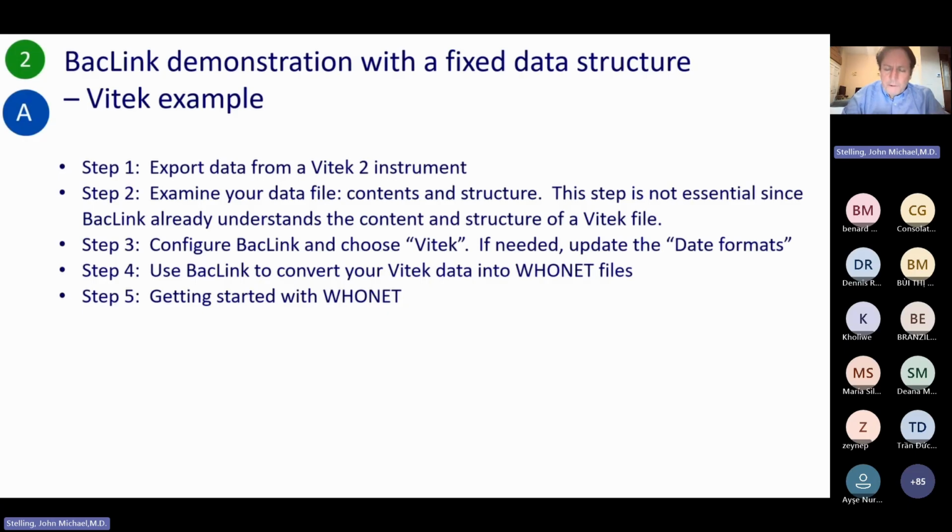As I mentioned, what are the contents? Is everything there? Are the positives there? Are the negatives there? DISC, MIC test. If you're working with Vitek, it's valuable for you to do that, but it's not essential because BacLink already knows the answers. It's good for you to know the answers, but BacLink already knows the answers. So we will do step two, but whenever you have a fixed data import, it's less important. There is value, but it's less important.